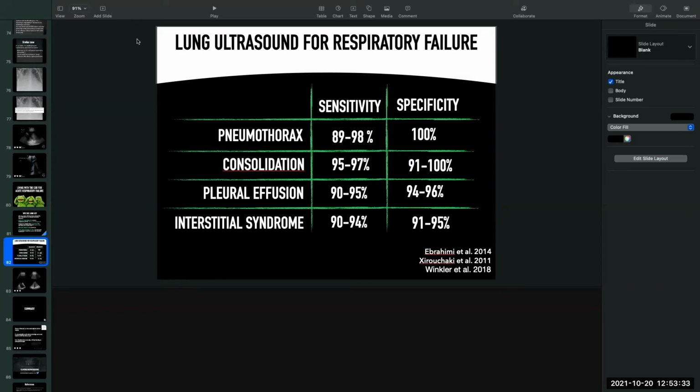And the last thing I'll say, and I'll impress this primarily on our trainees, if you ever work with me or Brian and you don't do a lung ultrasound before you reach for a bronch or you reach for a chest tube, you have not done the patient any favors. Left lateral decubitus chest X-rays are useless now in the setting of having lung ultrasound. And the reason why I say this is because there's a lot of our colleagues in the States and in Canada who have become expert witnesses for patients who've had iatrogenic complications, or misadventures, or they grabbed the bronch when in fact it was a pleural effusion, or they grabbed a chest tube when in fact they needed a bronch. The lung ultrasound, again, is your friend.